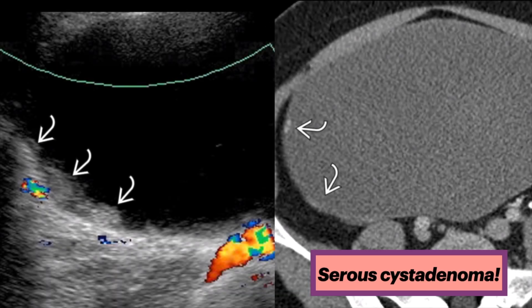In this separate case, here is an ultrasound showing subtle nodularity along the right lateral margin of the wall. Corresponding contrast-enhanced CT shows subtle enhancing nodules at the site of the sonographic finding. These findings correlated with areas of focal borderline neoplasm.